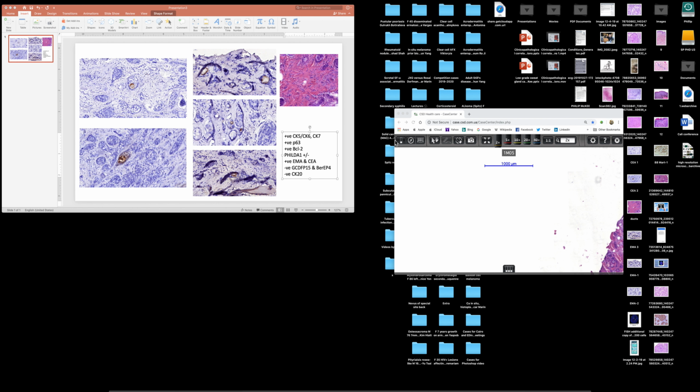In a previous video, I showed a classical example of microcystic adnexal carcinoma that was shared with me by Corey Georgeson. And in this one, I'm going to show another example that was kindly shared with me by Antonina Kalmykova of CSD Healthcare in Kyiv.